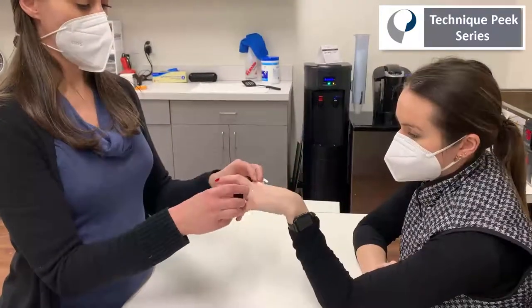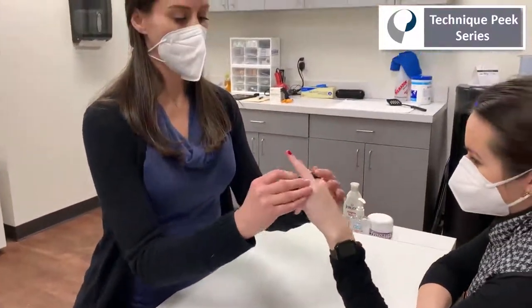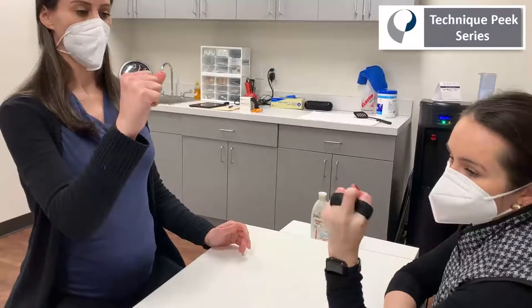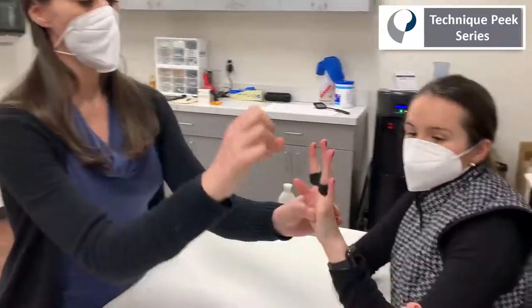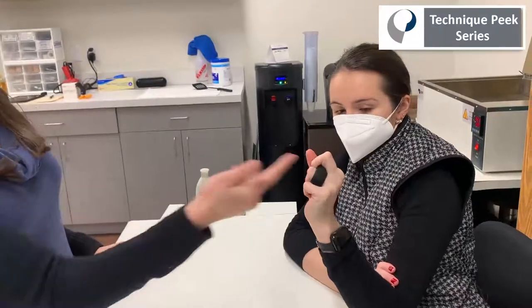This should be able to just slide on and off nice and easy, and then she's going to slide it back on. She will be able to make a fist all the way down and then all the way straight. As she makes a fist, it's limiting that MP flexion fully, so those strong extrinsic flexors are redirecting their force to that PIP joint.